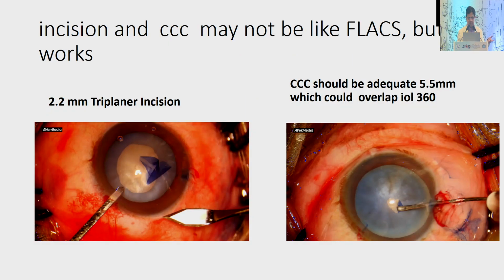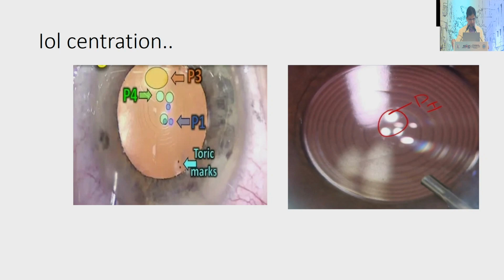Now, you don't always need femto. You can go with a manual CCC and this already. This is another important point I would like to say. These are the IOL centration.